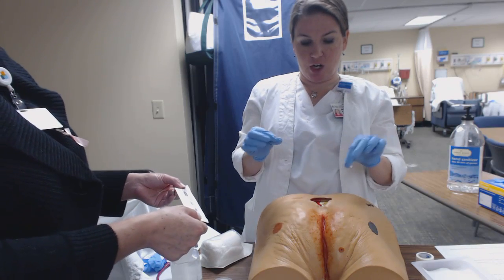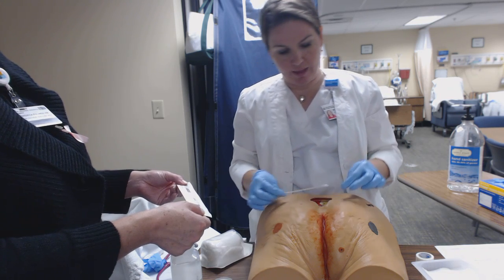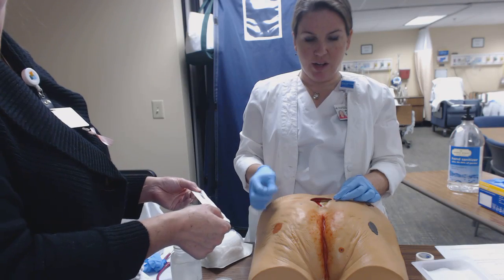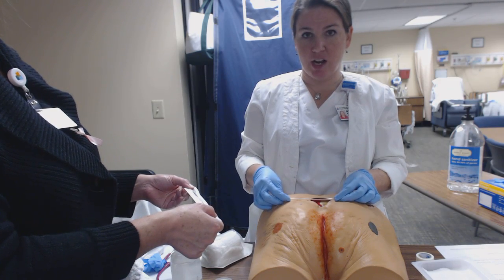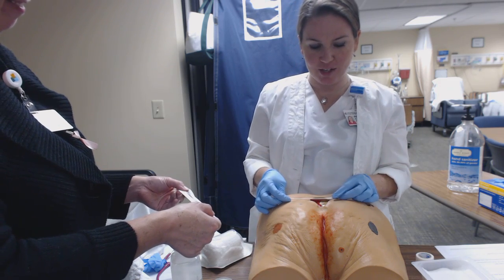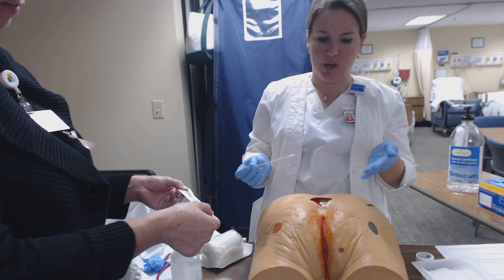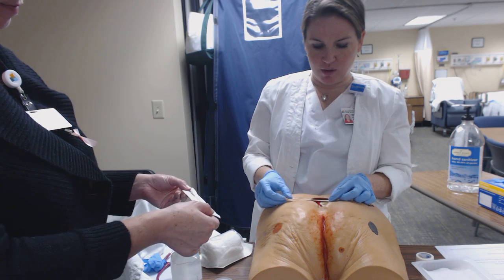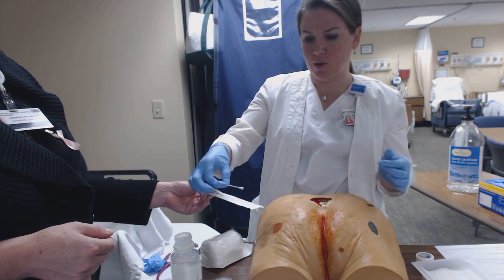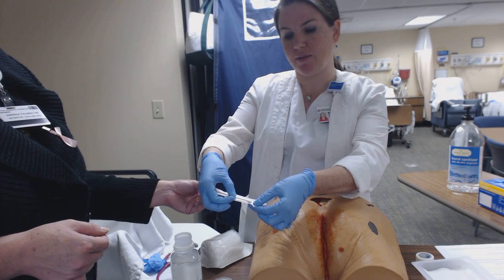So then we're going to measure width and length. Width is the widest part of the wound. So if you sang the song as a child, deep and wide, deep and wide, that's where this comes in. We're going to measure wide, deep, and then long. Or if you do carpentry, but I know nothing about that. So we're going to measure here. And that's going to give us the width of the wound. And I'm going to bring it over here to my measuring tape. And it looks like it's 5.5 centimeters.